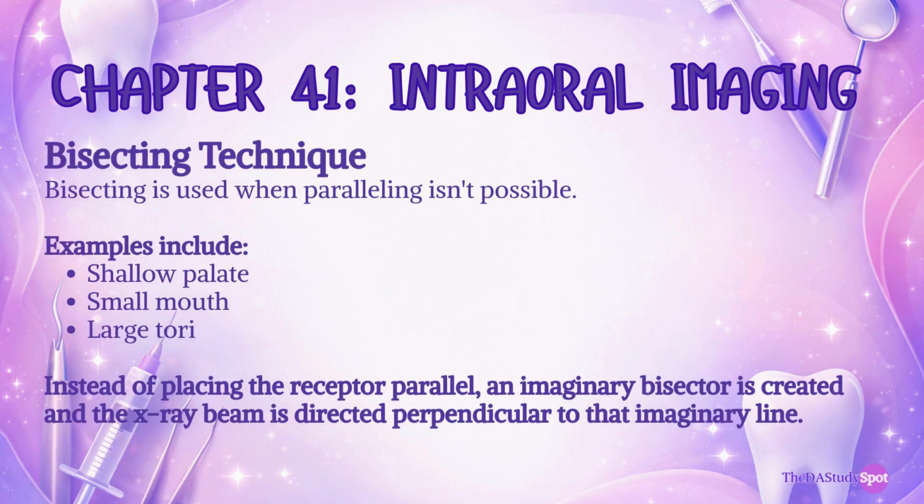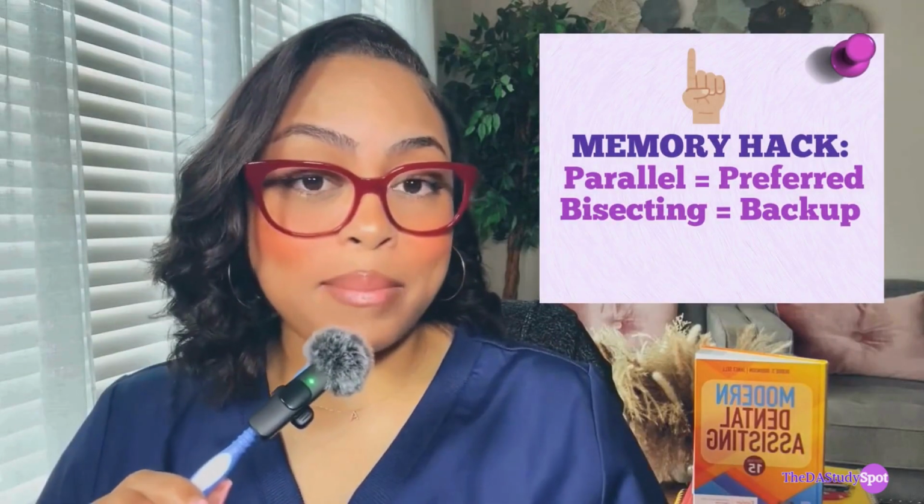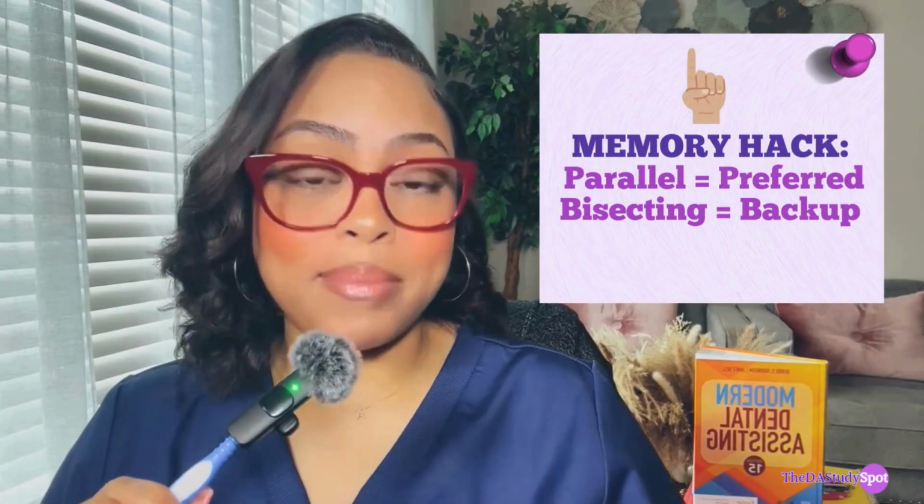The bisecting technique. Bisecting is used when paralleling isn't possible. Examples include a shallow palate, small mouth, or large tori. So instead of placing the receptor parallel, an imaginary bisector is created and the X ray beam is directed perpendicular to that imaginary line. Memory hack. Parallel equals preferred, bisecting equals backup.